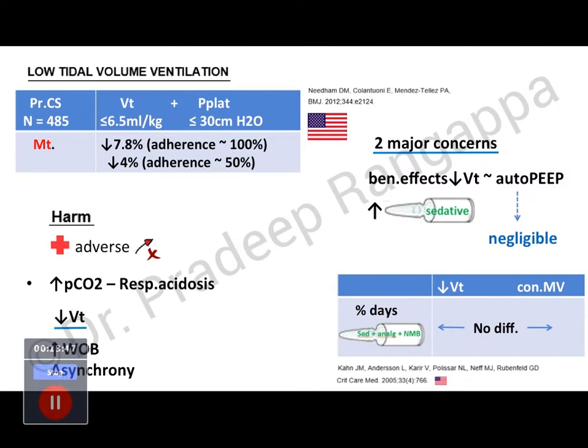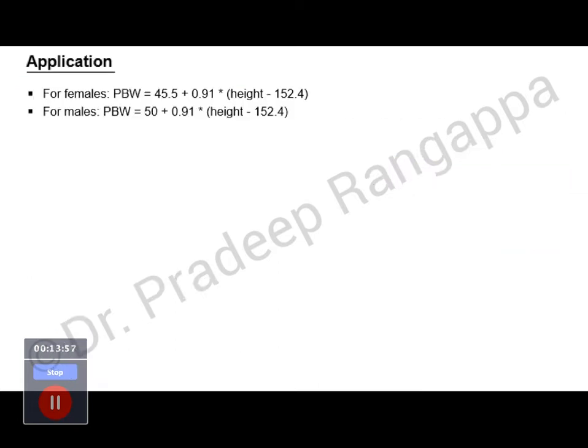Which means to say, although you may need to use more sedation, that may not be very clinically significant, or statistically at least it was not found to be significant in the study that came from USA. I think this slide would be extremely important for people who are playing with ventilators.